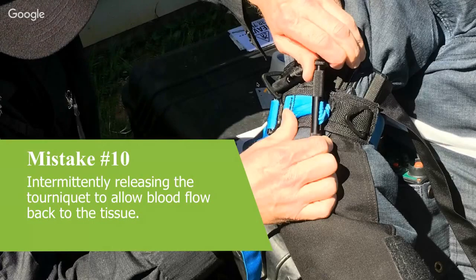The concept behind loosening your tourniquet is that you can allow a bit of blood flow in, allow those tissues to get some oxygen, get some waste products out of that limb. It'll rebleed a little bit, but then you do it back up again, and the tissues have had a chance. It's like being underwater, coming up, taking a breath, and then going back down underwater. The reason it's a no-no is a variety of reasons. If you put it on, you put it on for a reason. They're going to bleed out from massive hemorrhage, so you put on an arterial tourniquet. It's a life-saving device.